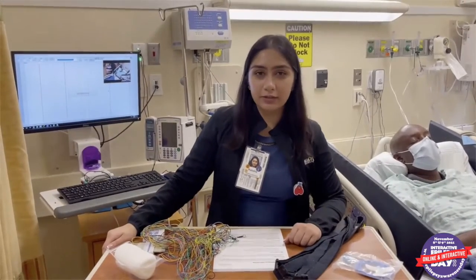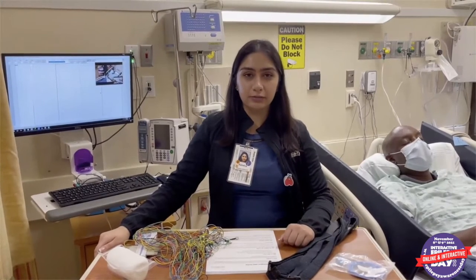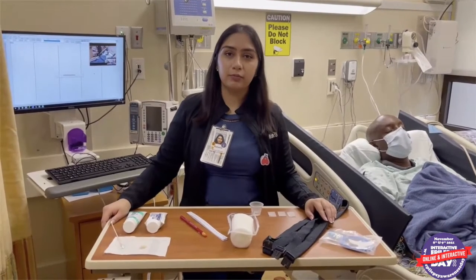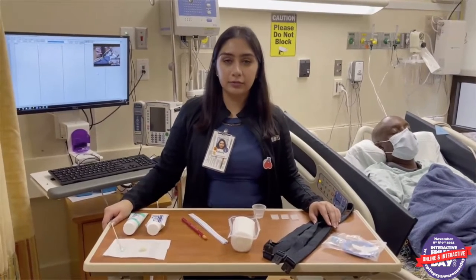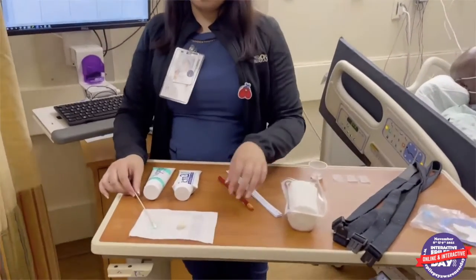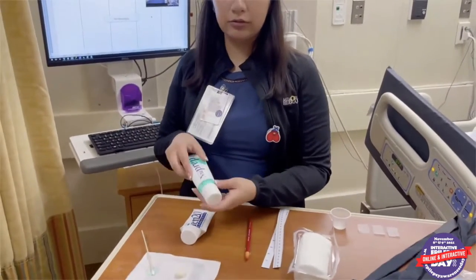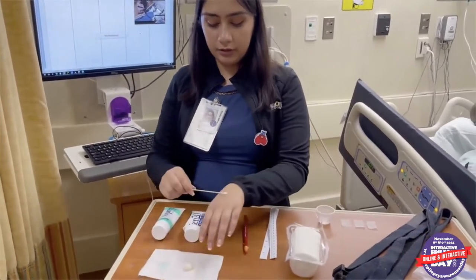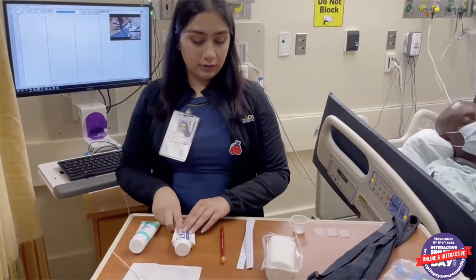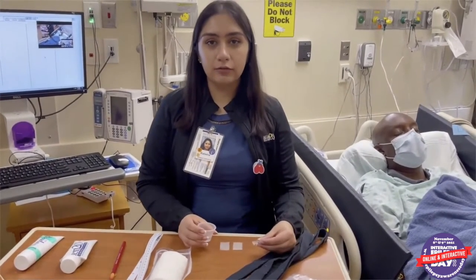You can be getting an EEG for a lot of different types of reasons. It could be for epilepsy, unknown seizures, or even dementia and loss of consciousness. To prepare for your EEG, you'll want to wash your hair the night before, but make sure not to use any hairspray, conditioner, or gels. Whenever we prepare your EEG, we'll be measuring and marking with the crayon and the measuring tape. We'll be using a gentle scrub to exfoliate your scalp, and then a conductive paste to make the electrodes stick. After that, we'll also add an extra adhesive to make sure they stay overnight and for a couple of days as well.